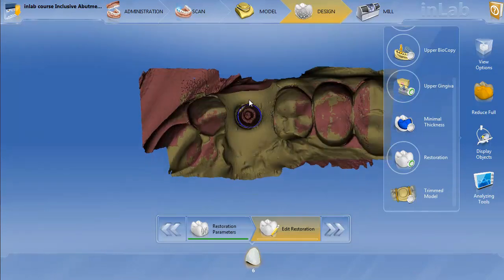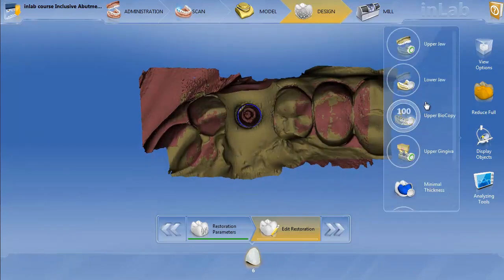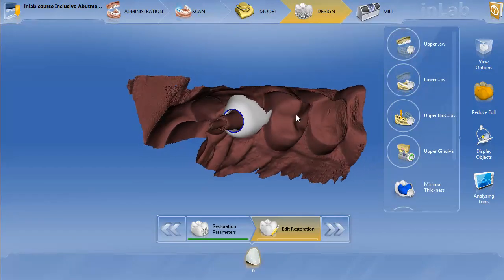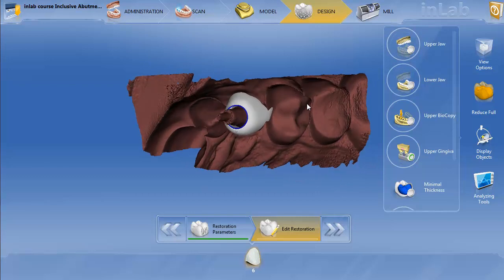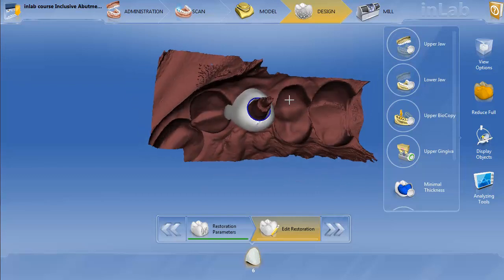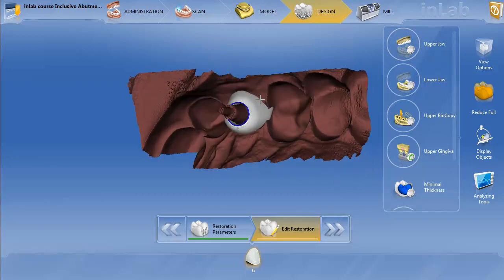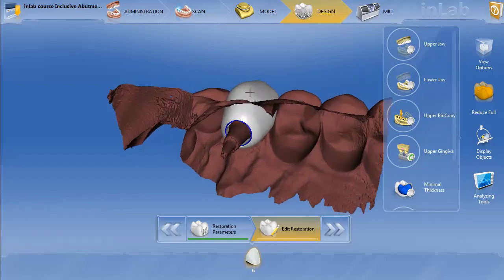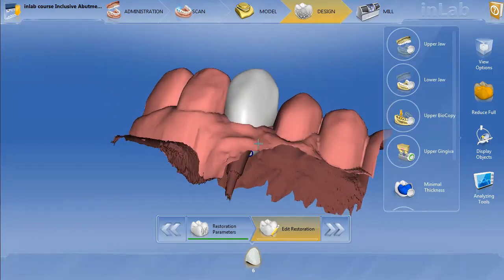If I want to turn it over and turn off the upper jaw, then you can get an idea. You can actually make the emergence profile a little bit less or a little bit more concave there if you want.